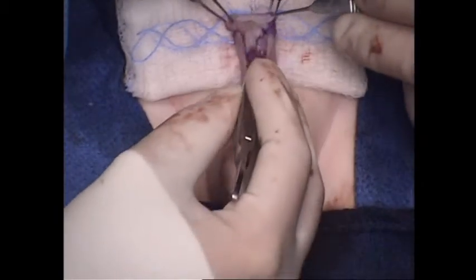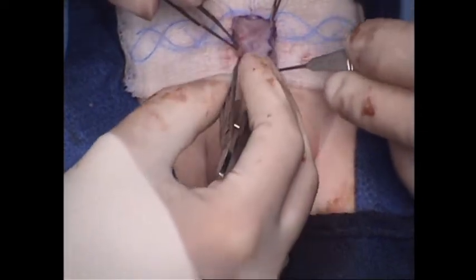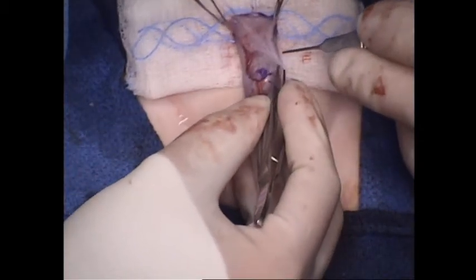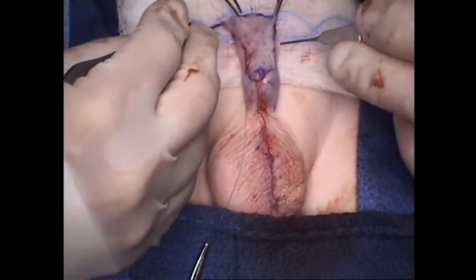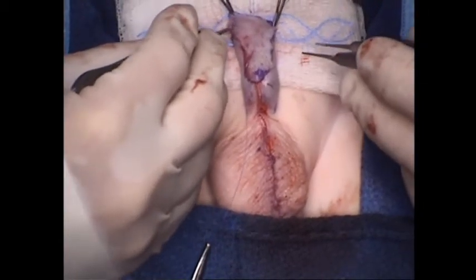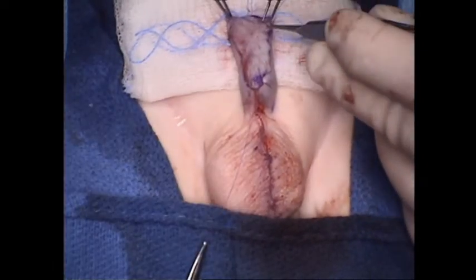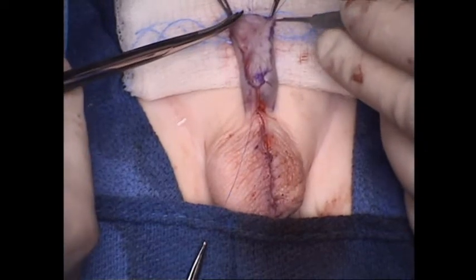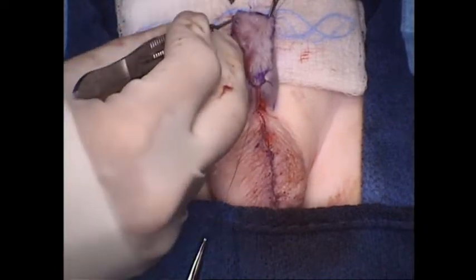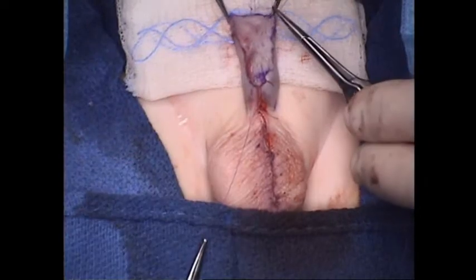Play a minute to see which way the graft lays the best. And that looks pretty good. So that's partly why we don't remove these stays here. It makes it much easier to move the graft around at this stage in the game. But now that it's in our way for laying it out smoothly, we'll go ahead and move that. Are you good? Yeah, I think that works for me.